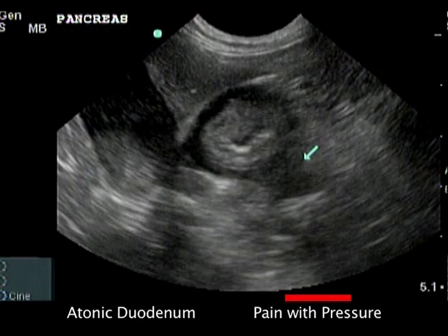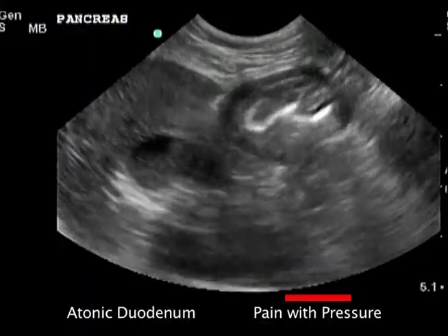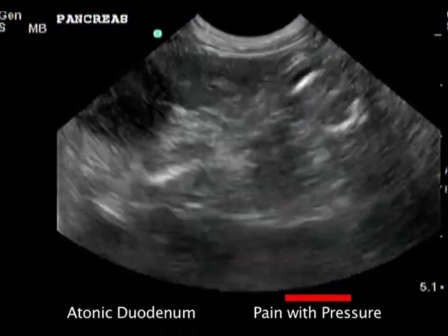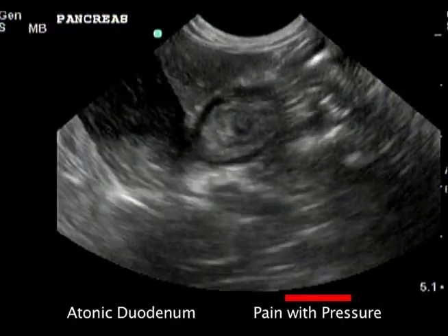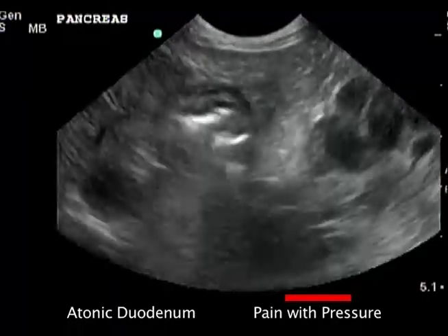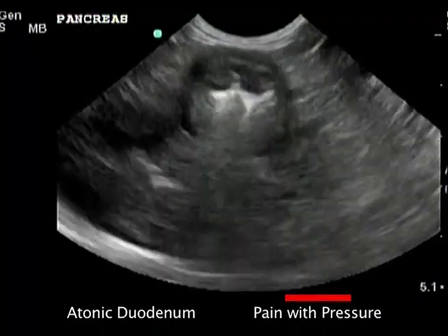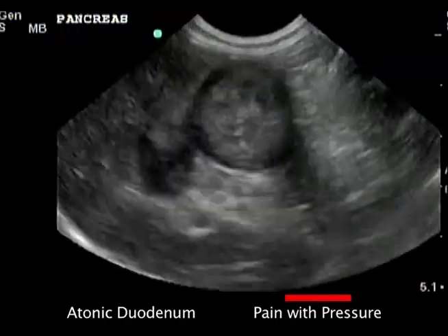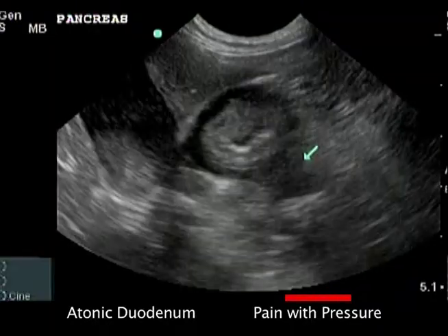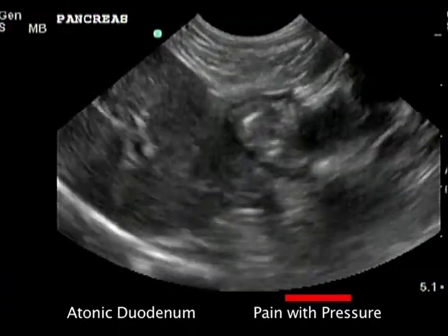In some cases, a patient who has been cooperative during the initial ultrasound suddenly begins to struggle, cry, or try to bite or scratch when transducer pressure is placed over the pancreas or right upper quadrant of the abdomen. It looks like this on the ultrasound from a 13-year-old 12-pound terrier with pancreatitis and a cystic mass caudal to the stomach. The patient is trying to tell you something. Do you hear? The patient did not struggle during other parts of the exam.